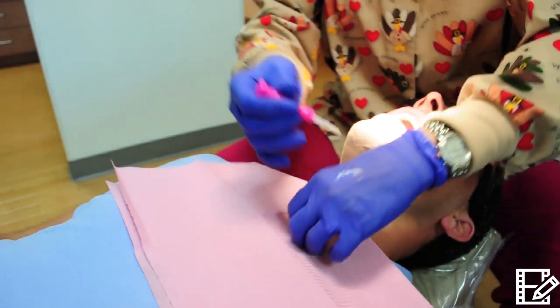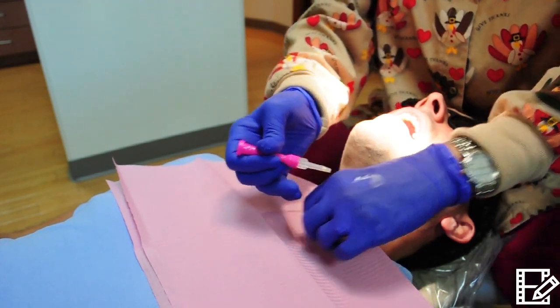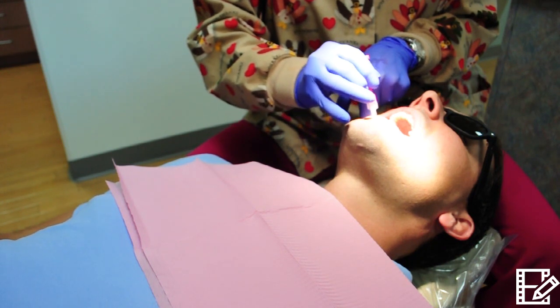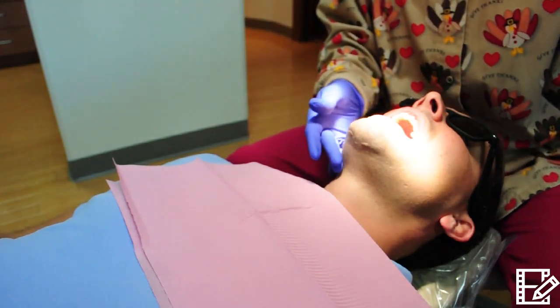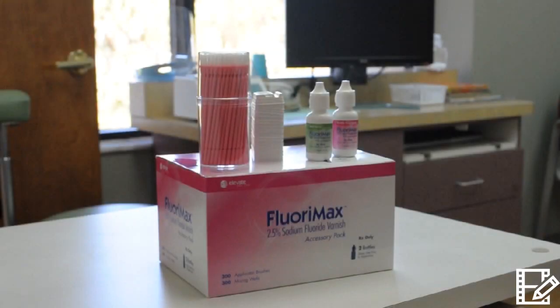Then one swipe across the buccal surfaces is all you want. Again, if you see white streaks, you've applied too much. For primary dentition, it's easiest to have them bite together — give a big smile and apply Floromax to the upper and lower arch in one single swipe on each side. After application, wait three seconds for the layer to dry and you're done.